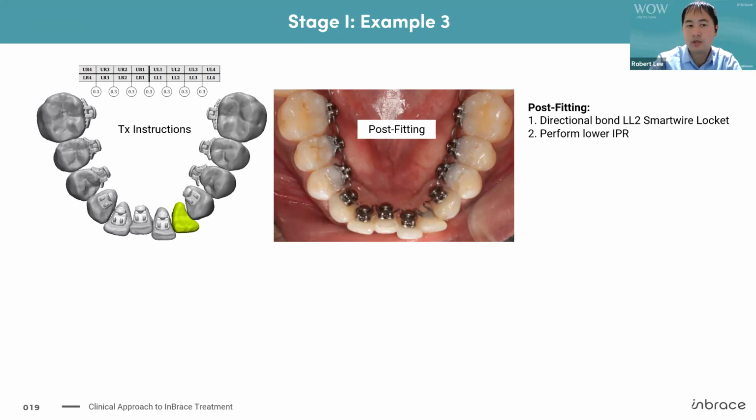So usually I just tell people, think about if you had a lingual button and you put a lingual button on this spot, or you wanted to put the bracket in this, where would you put the bracket? In this case, you would put the bracket as distal as you could because you're trying to rotate the distal in. So you want to activate the IP loops by bringing that bracket again as distally as you can. So you want to put some direction or directional thought behind where you're bonding the wire to the tooth.